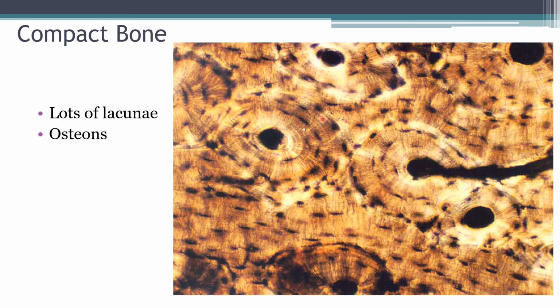Those dark spots are the lacunae, where those osteocytes, those bone cells, would live if this were still a living tissue. Now, this is compact bone, and you're also going to see these eye-like structures that look like little eyes. These are called osteons, and that's a hallmark of compact bone, and you can use that to help you identify this as compact bone as well.